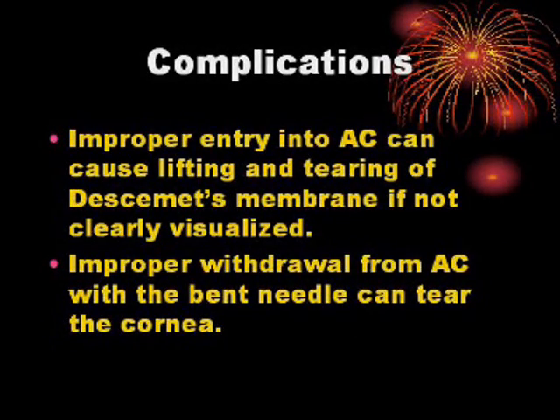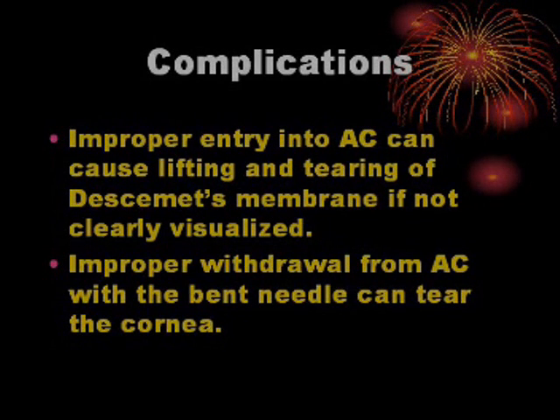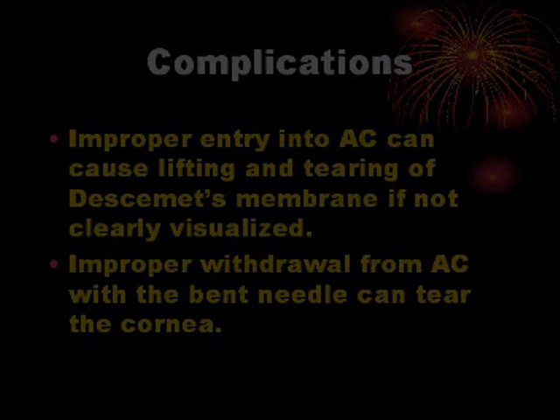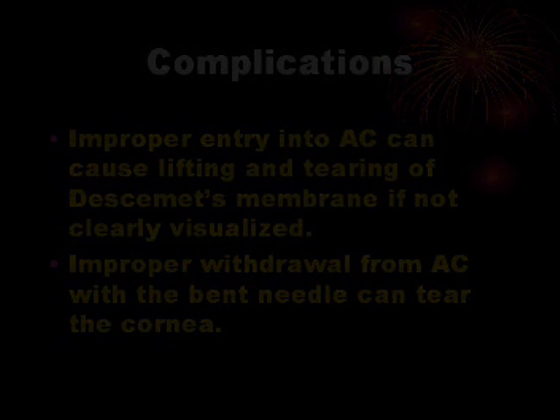Complications: Improper entry into the anterior chamber can cause lifting and tearing of Descemet's membrane if not clearly visualized. Improper withdrawal from the anterior chamber with the bent needle can tear the cornea.